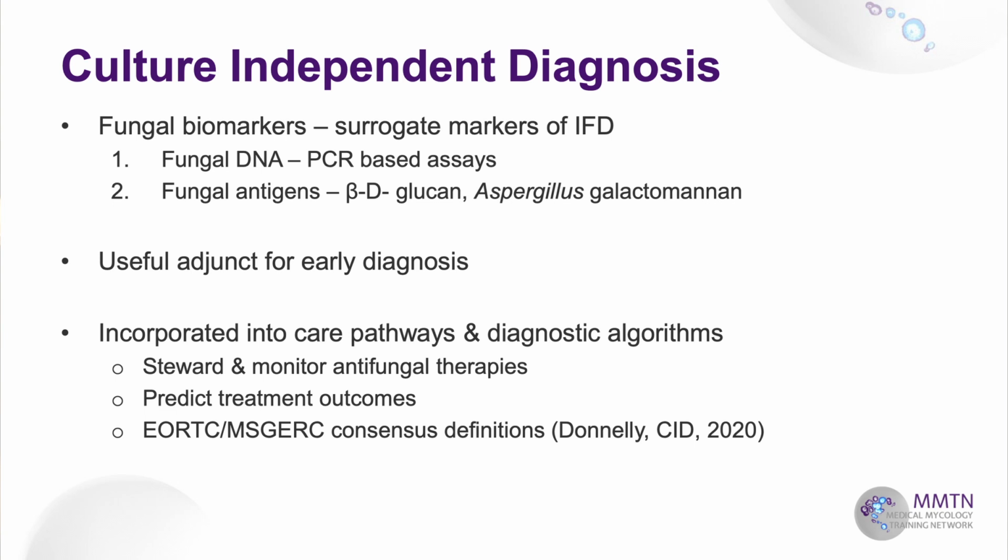And over the last 5 to 10 years, we've really seen these actually become useful adjuncts for early diagnosis of invasive fungal disease. And we've seen them incorporated into care pathways and diagnostic algorithms. We've seen them be used to steward and monitor antifungal therapies, to predict treatment outcomes, and most recently in 2020, we've actually seen some of these biomarkers incorporated into the EORTC MSG ERC consensus definitions.